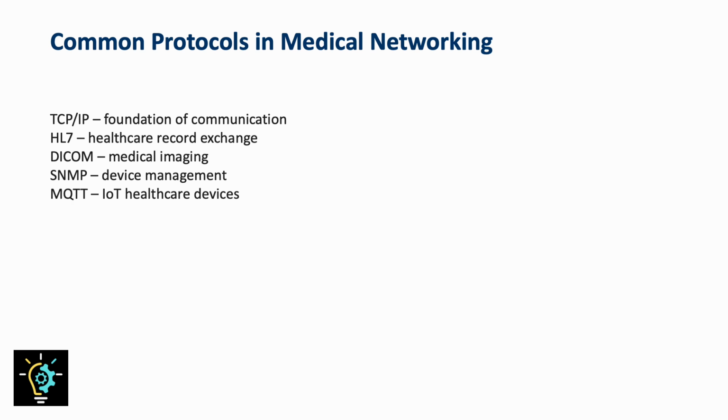Let's look at some of the most common protocols you'll encounter in medical device networking. First, TCP/IP. This is the backbone of nearly all modern communication. Then there's HL7, which is widely used for exchanging medical records between systems. DICOM is another, crucial for sharing medical images like MRIs or X-rays.